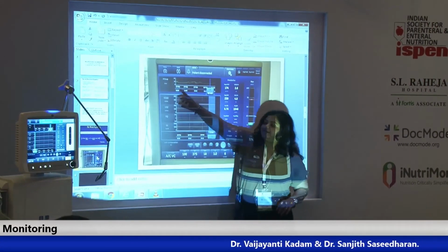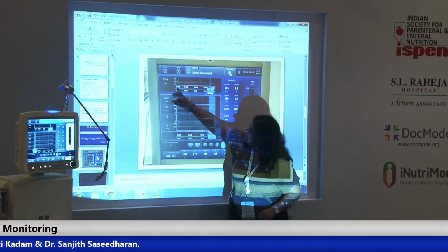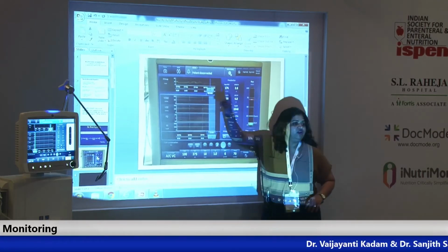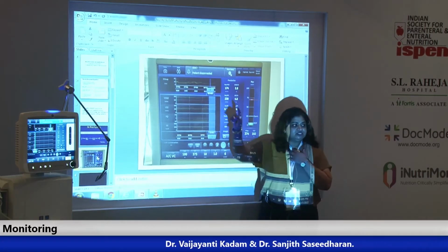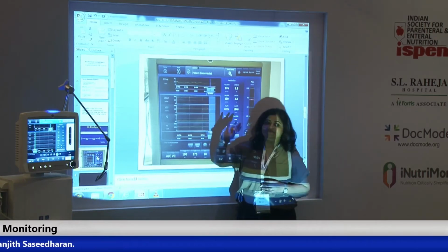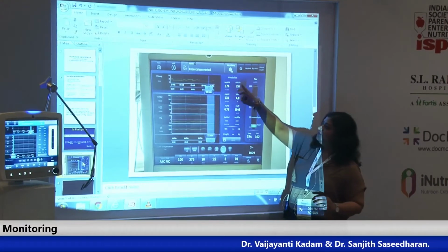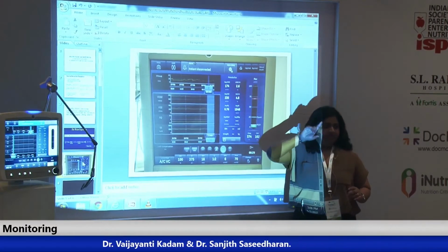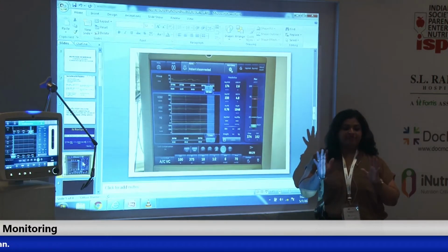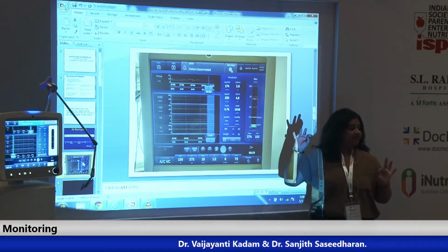My patient has been attached to this ventilator and this Escovix, from the 17th May to the 18th May. It will show a complete 24 hours window if my patient is connected for 24 hours. What I have to search for is a steady state. For a steady state, the variation in my VCO2 and VO2, the coefficient of variation, has to be less than 5%. The difference between the two has to be less than 5%.